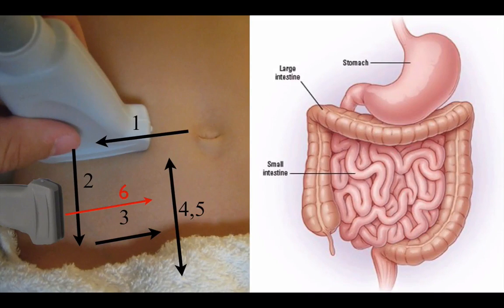Okay, so here's a preview of the scanning protocol and what we're going to be doing for the next couple of minutes. The reason why we're focusing on this area and having this exact protocol is because we want to identify the colon differently from the small bowel and then really isolate the area around the cecum. The idea is to find it, identify it, and then find the appendix coming off of it. The reason why we do this and not just go to where patients localize pain is because kids do a bad job of localizing pain. They rub their bellies like they're the Buddha or something. This way, you are identifying the cecum and you're going to be able to find that appendix. All right, let's keep going.